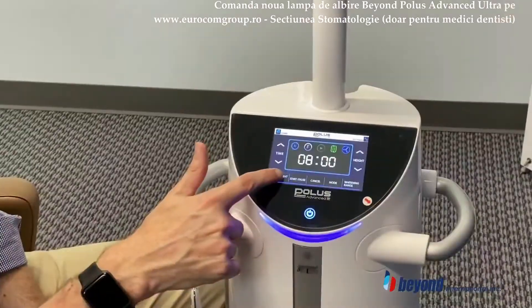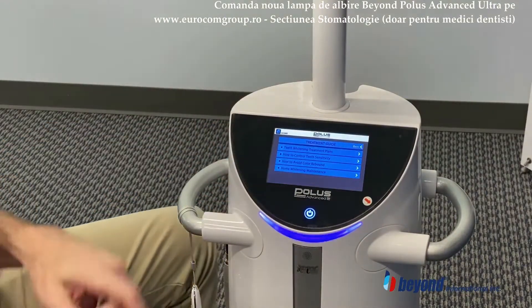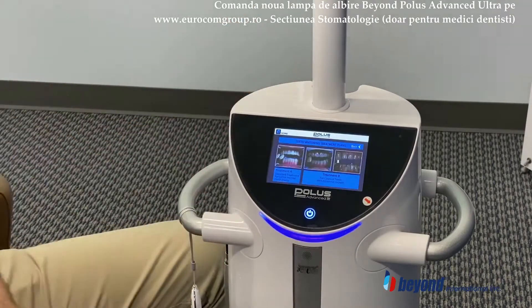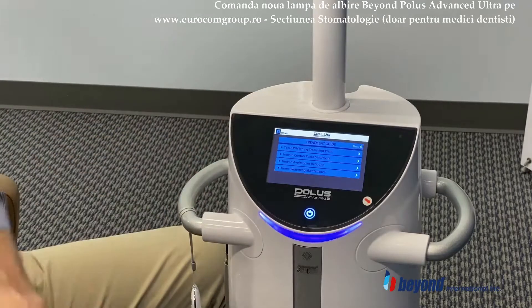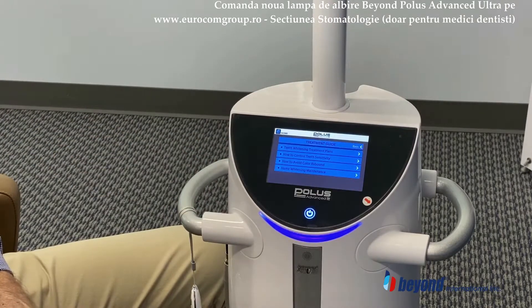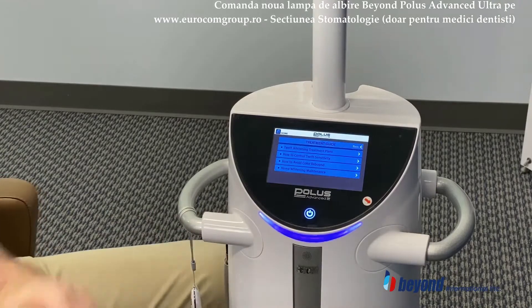We have the treatment guide function. That will allow you to look at the different treatment protocols you might want to choose from when it comes to treatment plans, for example. As well as how to control teeth sensitivity, avoiding color rebound, and home whitening and maintenance.